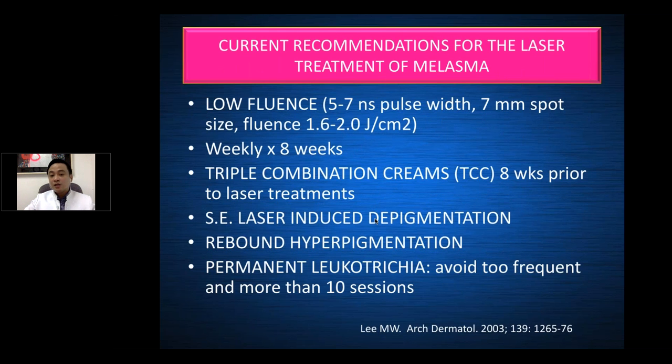So we deliver low fluence, and it is recommended that we do the procedure, for example, on a weekly basis or every 2 weeks until 8 to 10 sessions. It is recommended also that we prescribe triple combination creams, or we prepare the skin prior to the laser treatments. One side effect, we have to tell our patients that there might be a laser-induced depigmentation or rebound hyperpigmentation. So we should also avoid a permanent leukotrichia. So we should avoid very frequent sessions or more than 10 sessions.